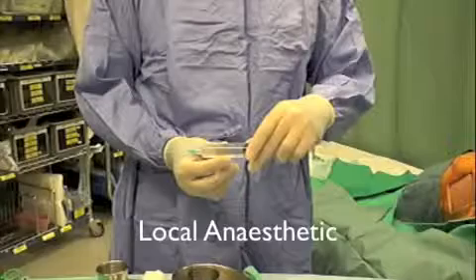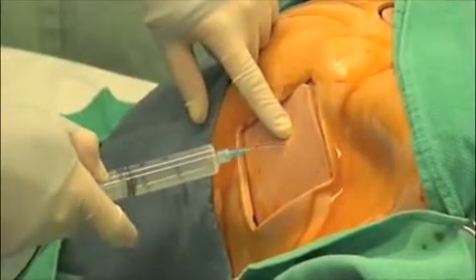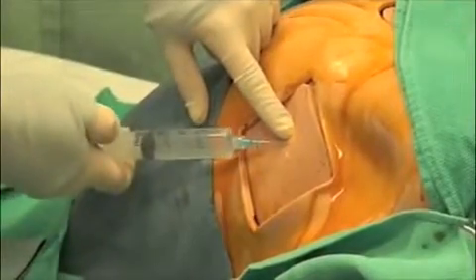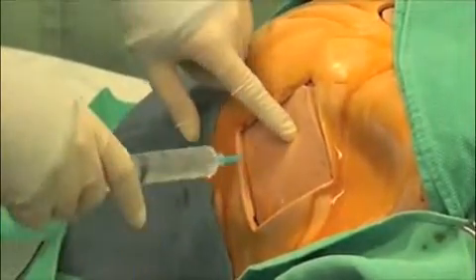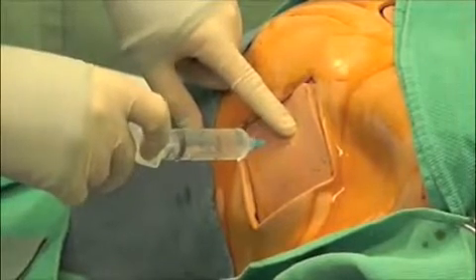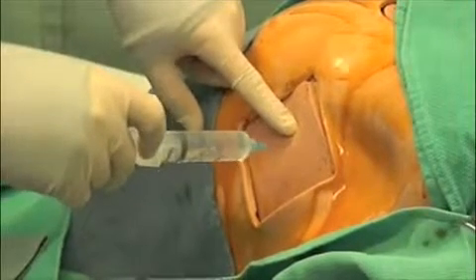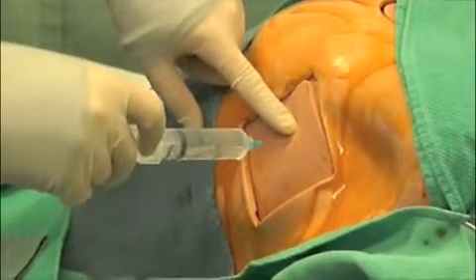Draw up 20 cc's of lidocaine. Re-landmark and infiltrate the skin using a 25 gauge 1.5 inch needle. Inject over the superior border of the rib to avoid the neurovascular bundle. Anesthetize the periosteum.